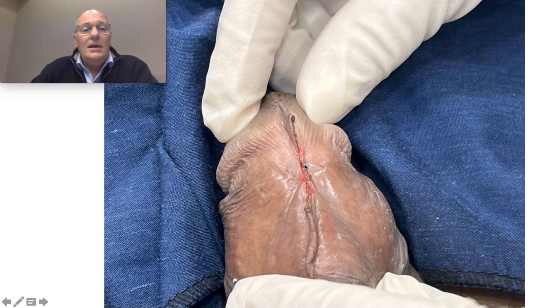Local anesthesia, no downtime — these stitches are reabsorbed in 20 days.